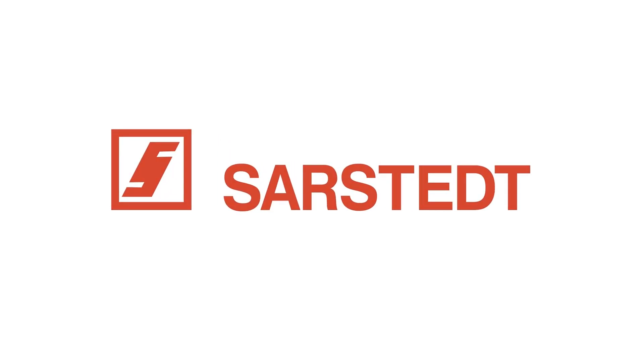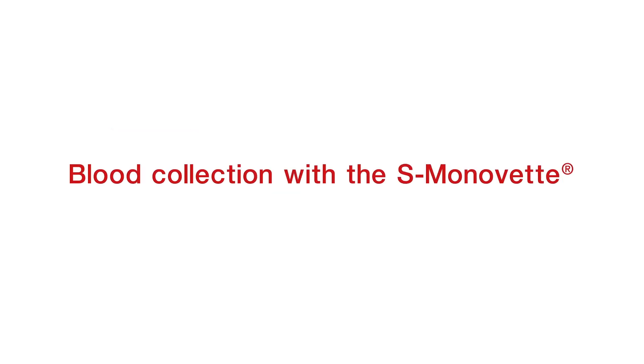Hello and welcome. Today we will show you how to collect blood using the Sarstedt S. Monovet and safety needle. In this video we will be introducing you to the vacuum technique.